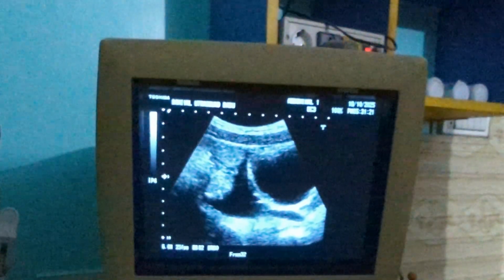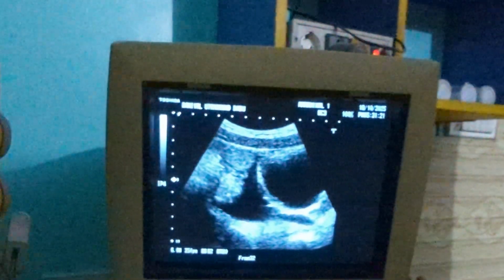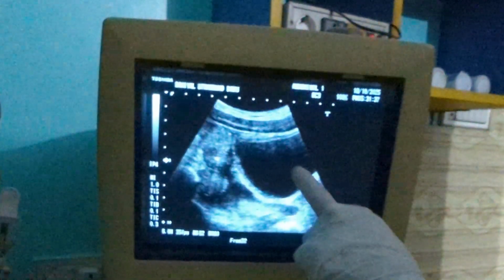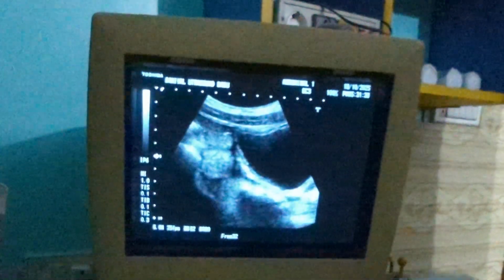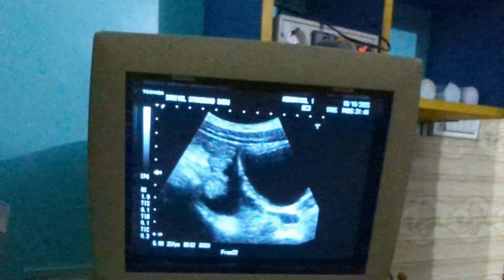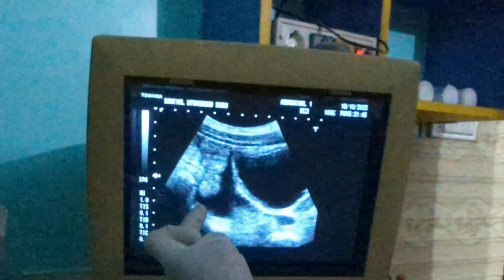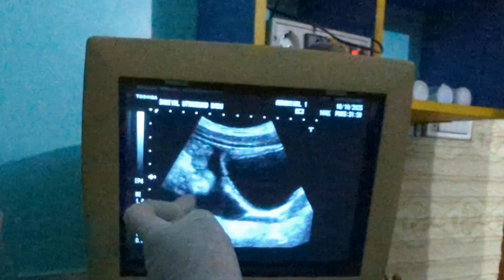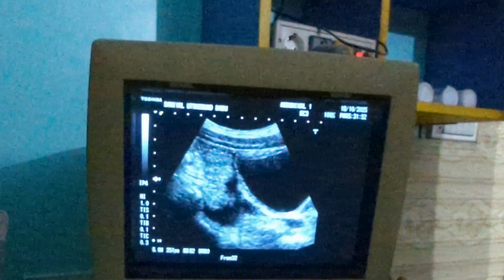Today we have got the topic of free peritoneal cavity fluid. So let me show you. This is the urinary bladder. I'm scanning the lower abdomen of an adult patient, which is showing this free hypoechoic area, which indicates the free fluid. And these are guts which are floating in the fluid.